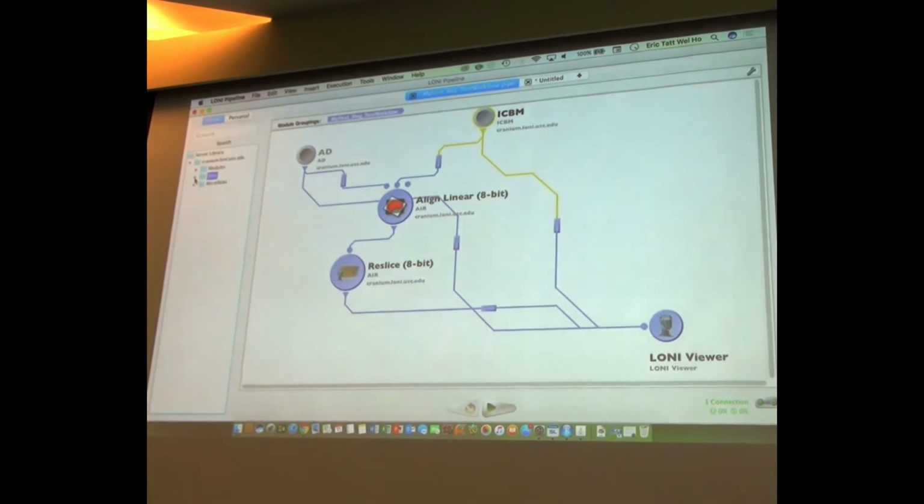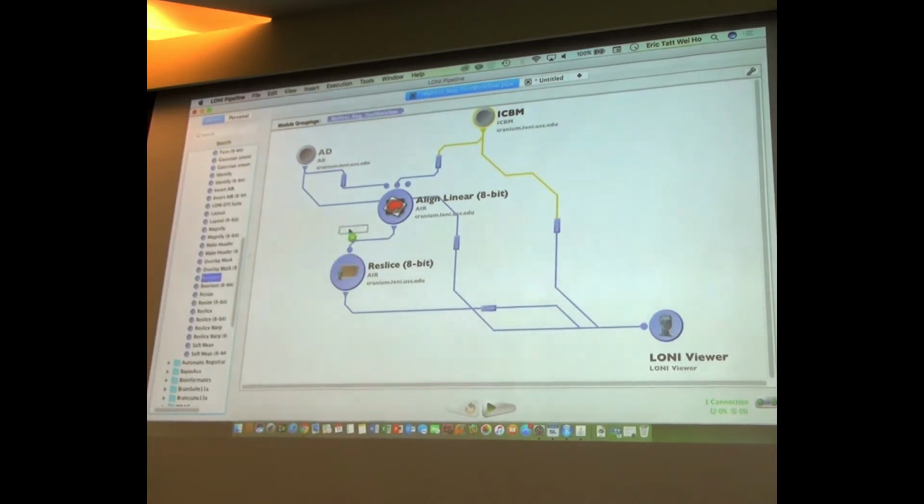Alright, bear with me, I have to put another converter here. Apparently the data that I chose may be a bit tricky. So hold on one second. Let me put another little converter here, in between these two.